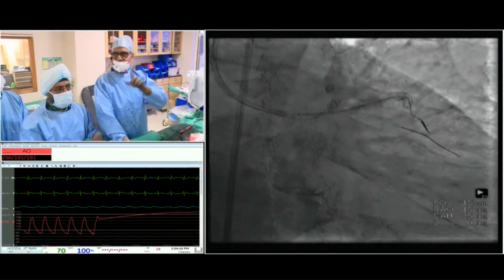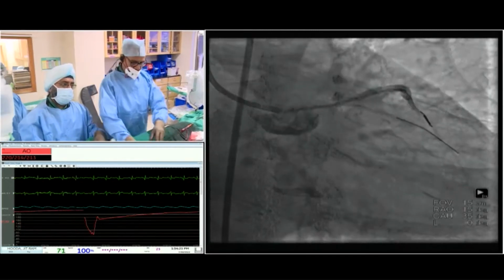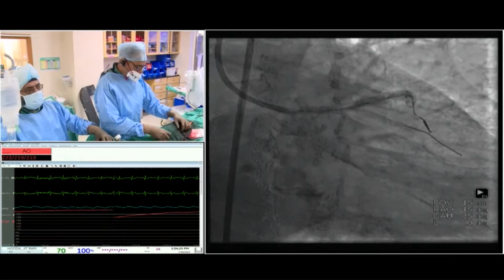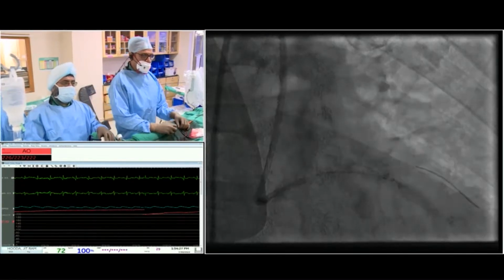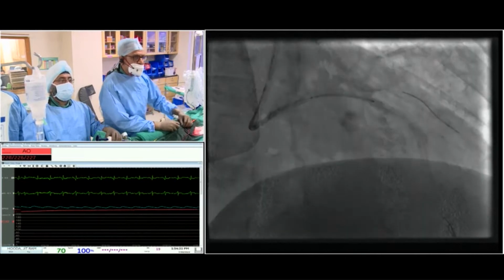Another aspect, apart from the size for a POT, is that the proximal vessel at the ostium should be totally free from disease. If you have mild disease, again, you might tend to dissect. I think that is another important reason for consideration. That's right. We want to come all the way to the ostium only if needed.